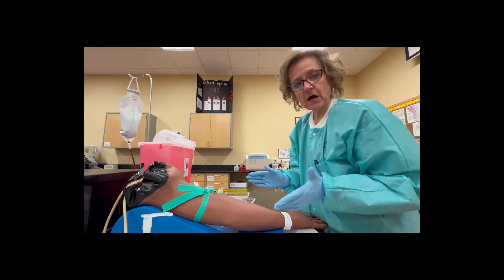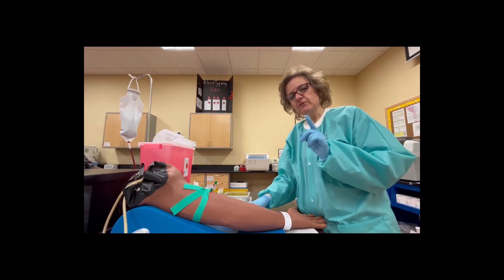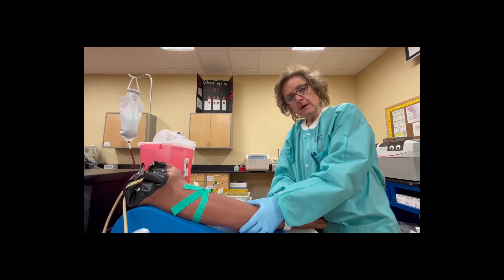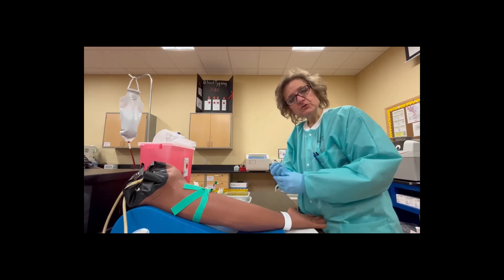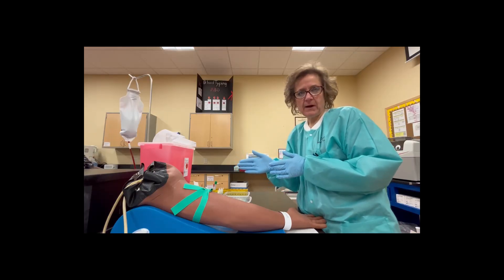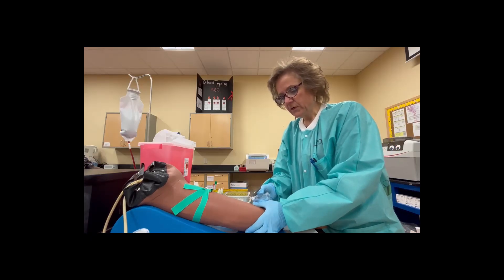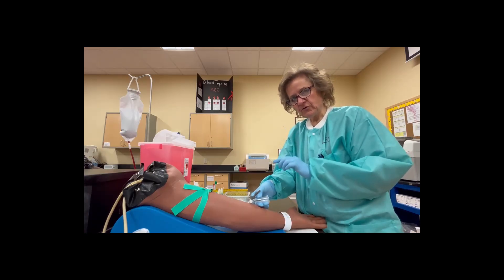I'm going to ask the patient if it's dry, then tie the tourniquet again — snug but not overly tight. When getting ready to go in, we're going to anchor the vein by pulling it nice and tight downward. By pulling it down, we're keeping that vein from rolling. If we don't do this, when we put the needle in it's likely to just push the vein out of our way. Check the needle, everything's open and ready to go — anchor the vein, and then: one, two, three, poke.